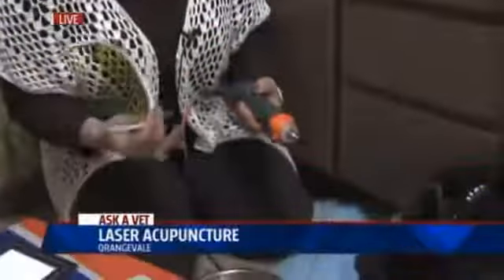Good morning, Paul and Bethany. This is an awesome new tool — amazing equipment for animals who don't like needles. We have what's called laser acupuncture.